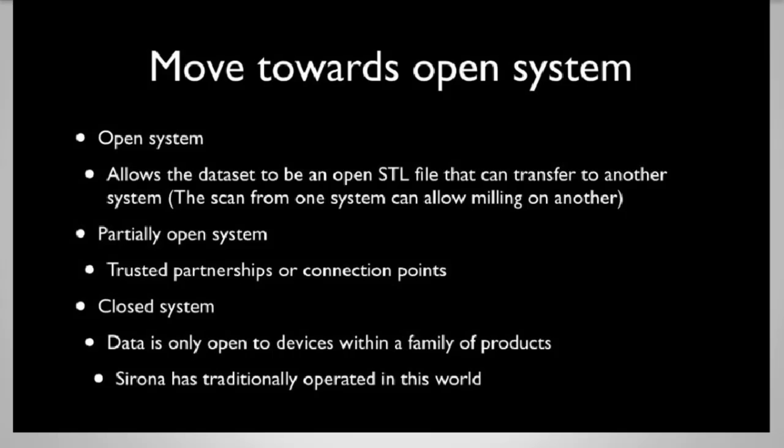So today, if I believe that, let's say, System A is the best impressioning system out there, and System X, made by another manufacturer, is the best cone beam CT system out there, today in a closed environment, I can't merge those two together. In an open environment, I can.